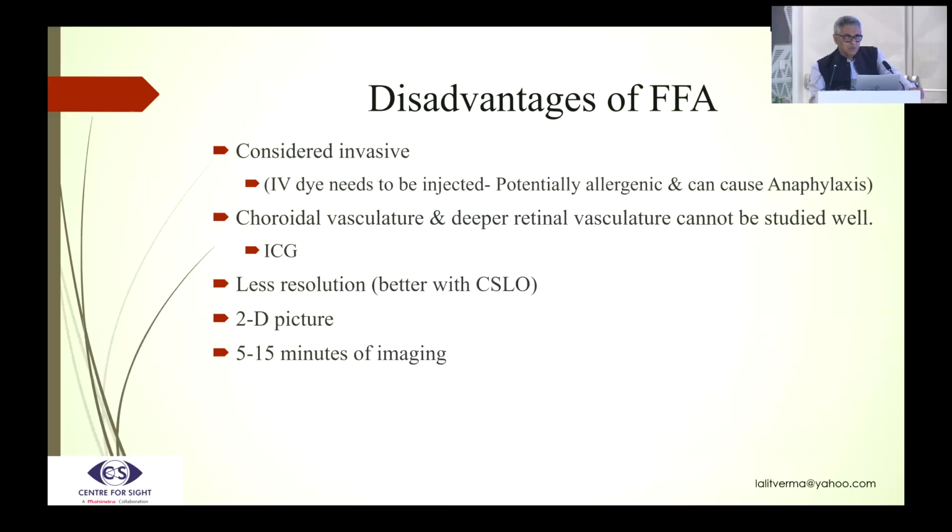The disadvantage quoted is that angiography is considered invasive. Even an occasional death has occurred. It also takes some time, 5 to 15 minutes of imaging, with less resolution.